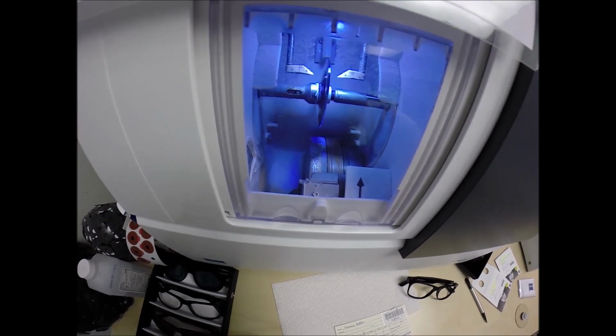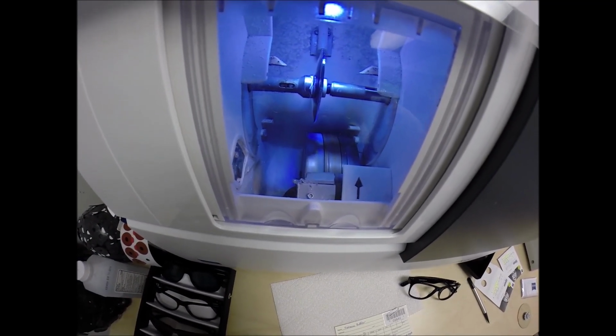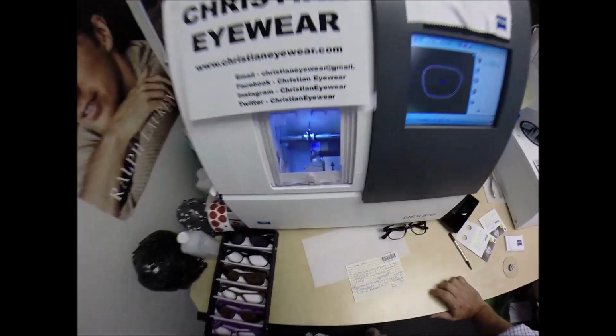So the lens is being traced by two white styluses, making sure it's large enough to go into the frame, and then measuring the thickness of the lens at every point to know exactly and precisely where to place the bevel, so I have the least amount of edge thickness showing, of which I won't have any because of my prescription in this thicker frame. But I do cut very strong prescriptions all day long for free.